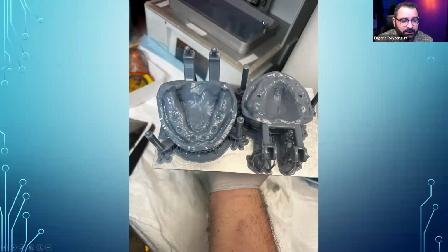Now you can see that I'm using just a hobby resin here because it's not going to be something I'm going to be making stuff on. It's just to verify stuff. I think I'm using Anycubic soy-based resin and a Photon printer, and I pay like 20 bucks a bottle for a kilo of this stuff. So it's really inexpensive. But fair warning, this stuff is not precise enough to do any kind of precision work.